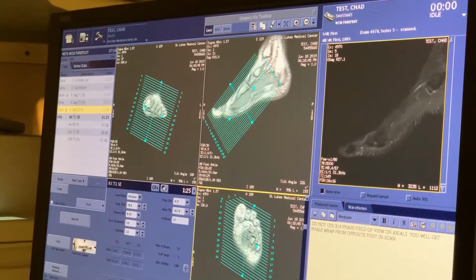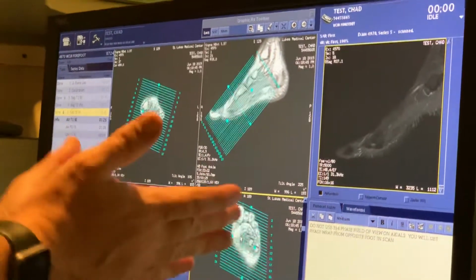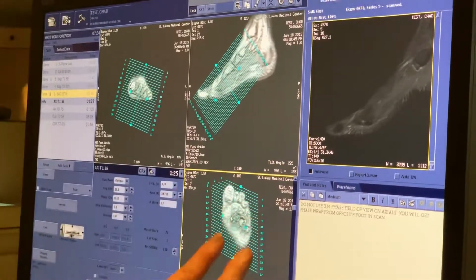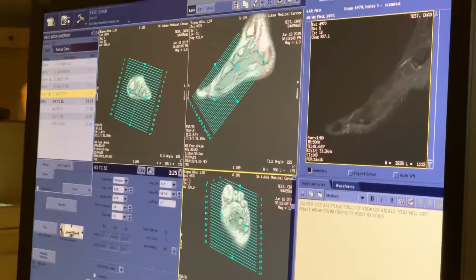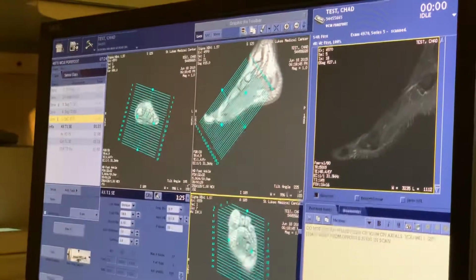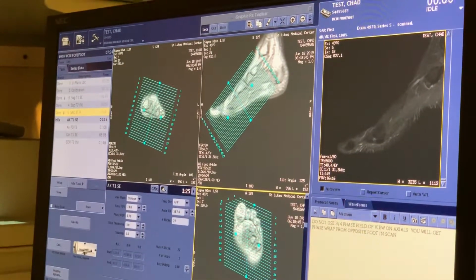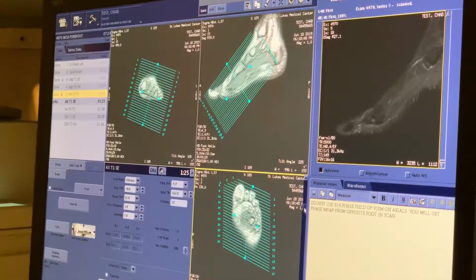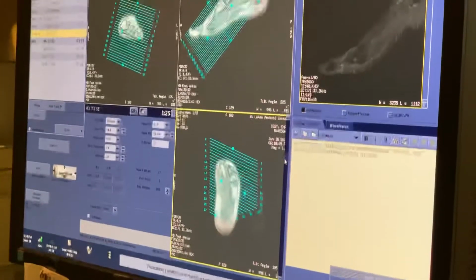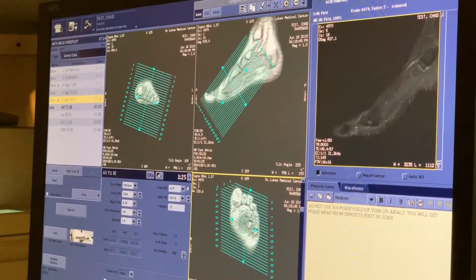again, I want to angle this sort of with the middle of the foot like that. Just like you have the foot. It's not like there's an actual something you can angle. You just imagine the foot here and then just put a line right through, like it was a piece of cake and you want to cut it in half. I don't know. It's hard to explain, but it's easier to see. You see how this is basically splitting the foot right down the middle there? And if I go this way a few more times, because the hind foot is on an entirely different angle than the forefoot, okay? And we'll go over that in a minute. All right, so I've done this.